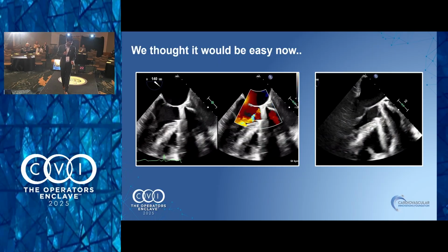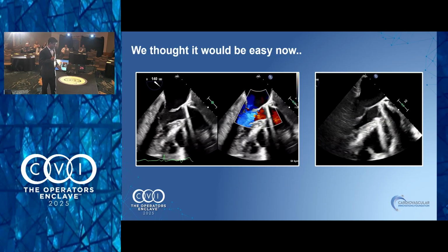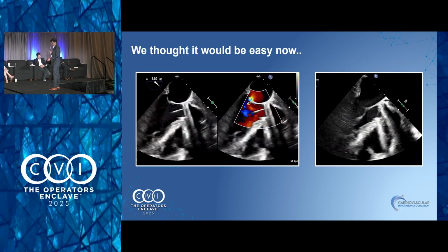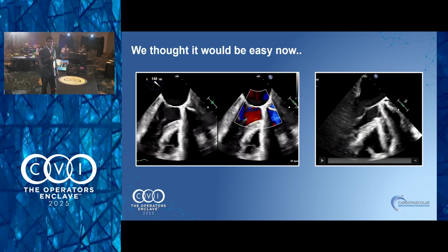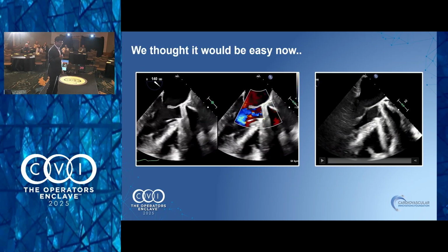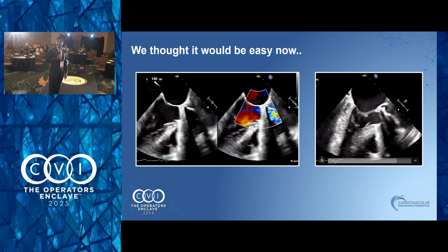So whatever wire we're putting, it's just flopping around, and it would easily go through the mechanical leaflets. And I think the hole was somewhere there. I literally remember this was 7 p.m. and I told my tech, we're going to try for 10 more minutes. If it doesn't, this patient obviously has no option. But at some point you have to be lucky. So the wire did cross.